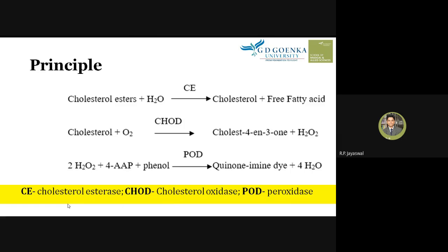Right? So, with the help of these three enzymes, which are present in the working reagent, we can react cholesterol and make a colored end product, and we can measure the intensity of the color of the end product to know the amount of cholesterol in the given sample.